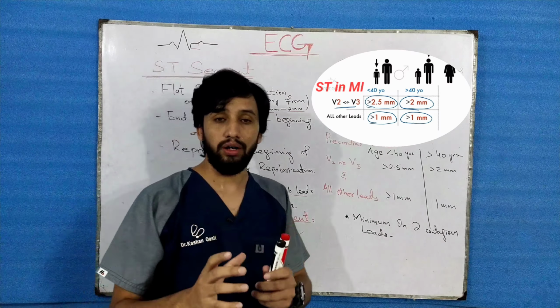Here come the last two alphabets. A is for acute pericarditis. It is acute pericarditis, not constrictive pericarditis. Finally, here is the B, which is the last alphabet of this mnemonic, showing Brugada syndrome, which is a sodium channel defect. So all these are the conditions in which you will see the ST-T changes, like ST elevation, usually on an ECG paper.